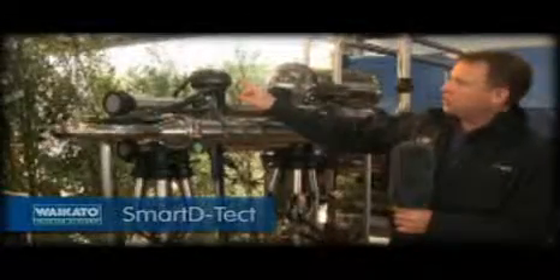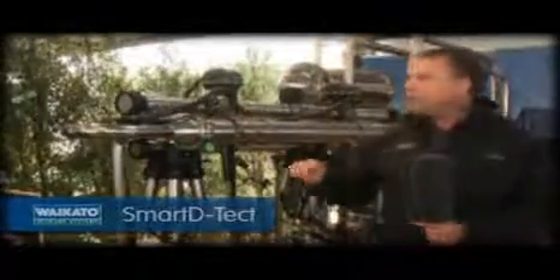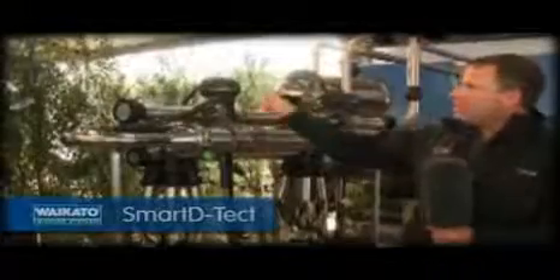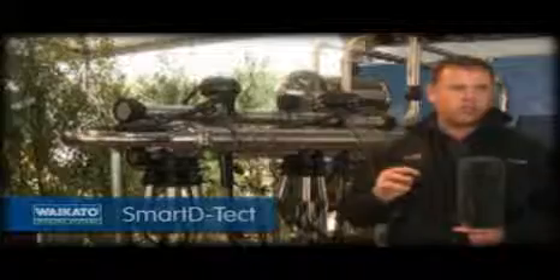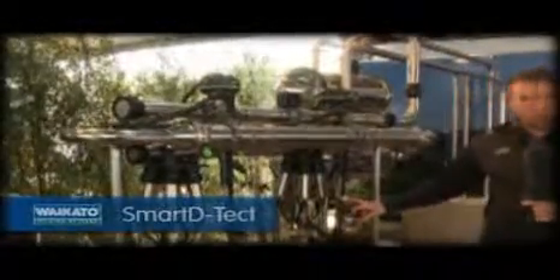Up here you'll see it's pulsing normally side to side. Now it's just switched into testing one quarter — it's milking through one quarter and doing a conductivity test on that quarter. Then it'll switch through to the second quarter, and that test is happening up here. By the time it's been through its whole sequence of all four quarters, it's going to compare those four. If the cow is in good health, it'll give us no alarm and just go back to pulsing normally.